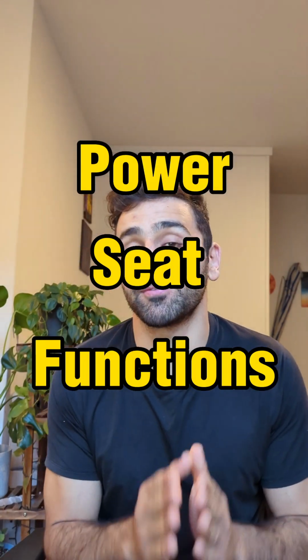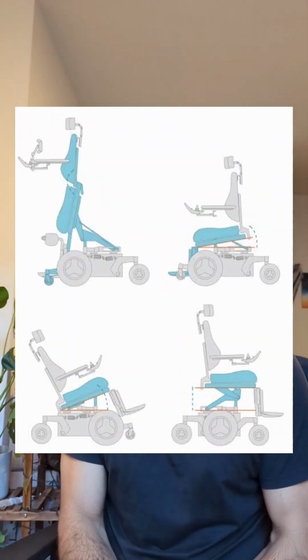Power seat functions are different angles and positions a wheelchair can go into using the joystick, alternate controls, or some push buttons. And one power feature that is pretty much on all configured power wheelchairs is tilt. Now, tilt or posterior tilt is when the entire chair moves back. There are no changes to the angle of the chair.